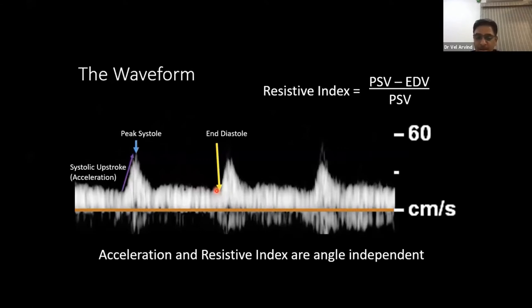But in our arena, in a patient with 3 or 4 years of renal graft coming for routine ultrasound examination, not only the resistive index matters. I tell you, after 3 or 4 years, the resistive index will not give any idea of the longevity of the graft, nor will it prognosticate the graft. Most important after 5 years of graft placement are your blood pressure control, creatinine level, graft size, and CMD, cortical medullary differentiation, all these things. If you can measure the entire graft volume, those are more important than the resistive index. But the pulsatility index has some value in that.